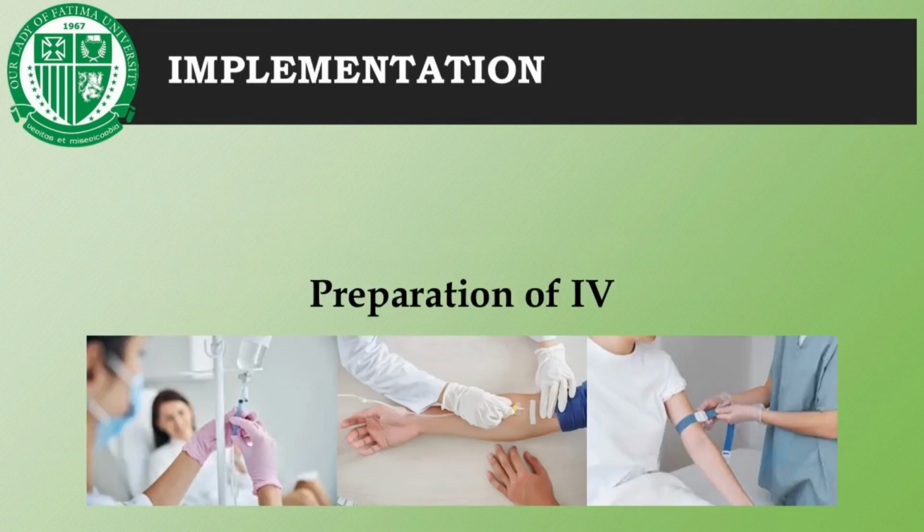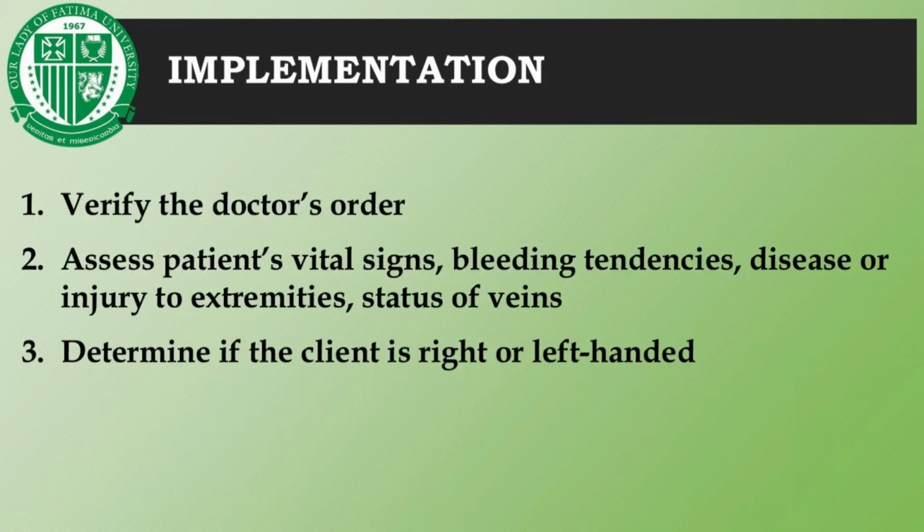Since we have enough knowledge regarding IV therapy, let's discuss how to properly implement the step-by-step process of preparing the IV line. The first step a nurse should do is to verify the doctor's order. Verifying the doctor's order ensures that the procedure is authorized, accurate, and aligns with the prescribed treatment plan.